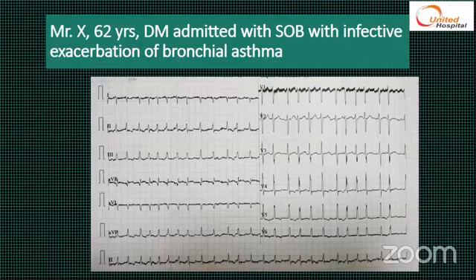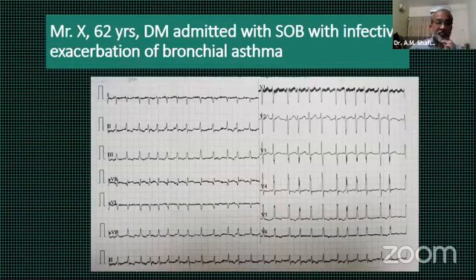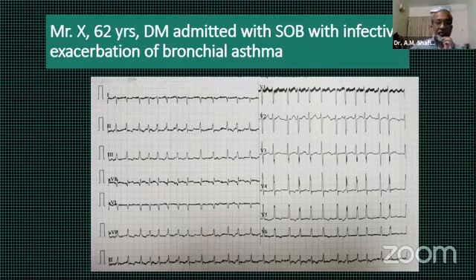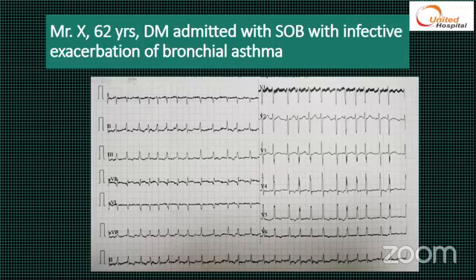Sir, in 1 and AVL, the QRS complexes are negative here, sir. One, AVL. And in AVR? In AVR, sir, there is positive R wave, and there is slight possibility of ST elevation in AVR, sir. A bit elevated, seems to be a bit elevated, sir.